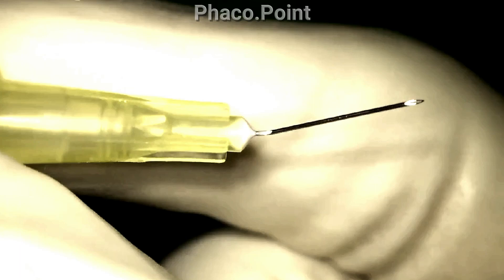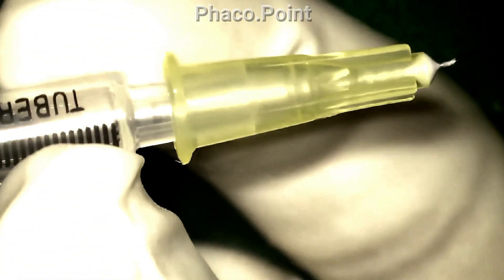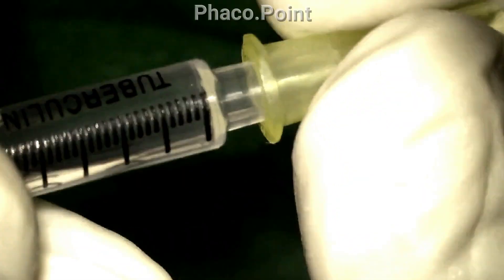In order to perform a Descemet's pexy, I take a 30-gauge needle that is just proximally bent at the hub. I ensure that if I have to have more than one injection, I change the needles because they do get blunt on repeated injections. This needle is then connected to a tuberculin syringe into which we draw the gas that we want to inject into the patient's eye.